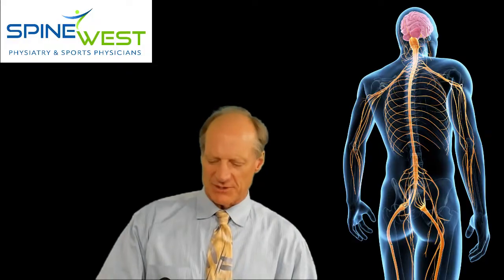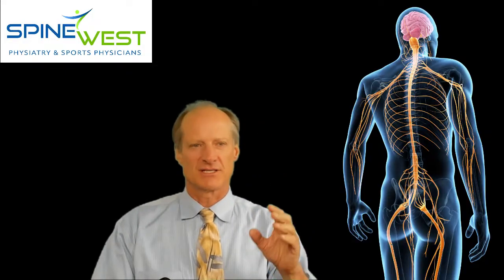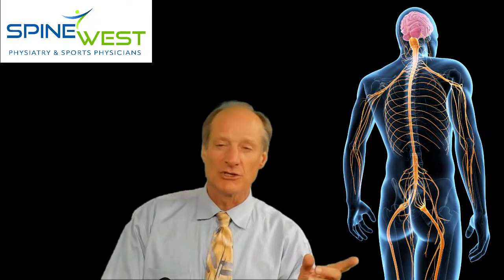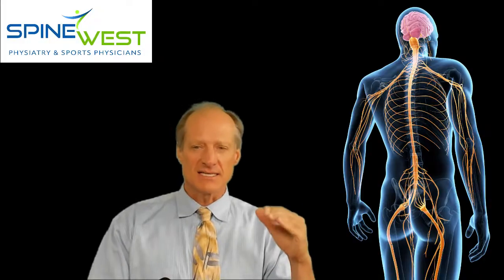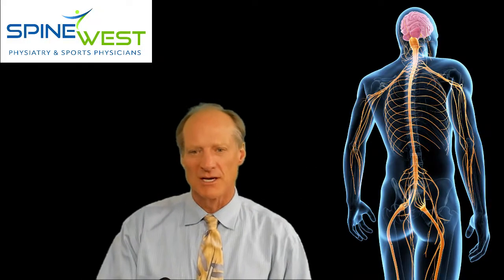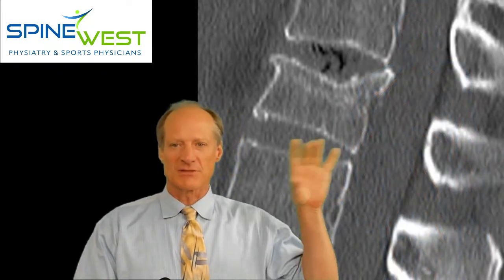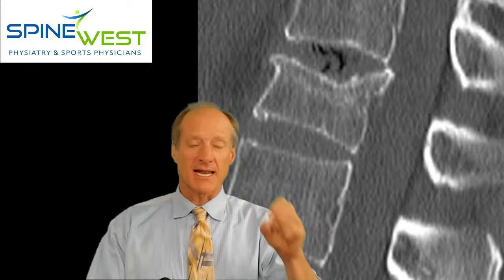So there are different types of modalities. There's X-ray, which is equal to CAT scans or CT scans. CT scans are simply stacked layers of X-ray that go up through the bones. You can see X-rays typically when you've got this gray, black and white kind of image that goes through the body.